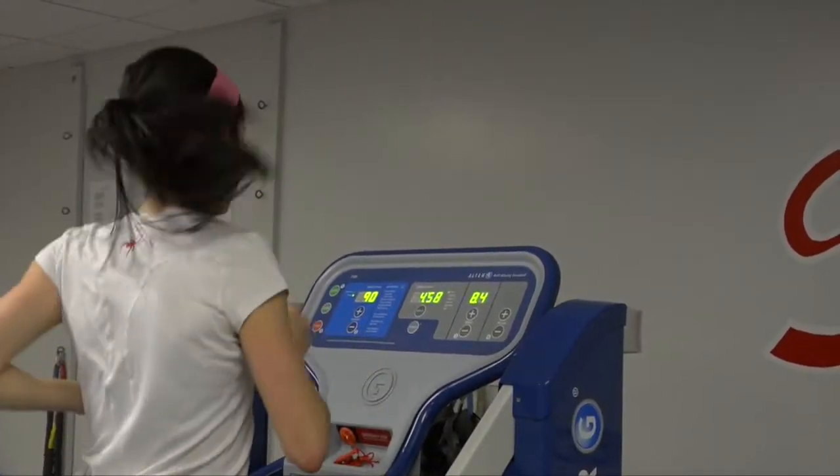With the Alter-G, it affords you the opportunity to run at a lower body weight percentage, so you can be more aggressive. For these athletes, that's what they want. Mentally, it really makes them feel better too, because they're getting back to fitness quicker than they otherwise might have been.